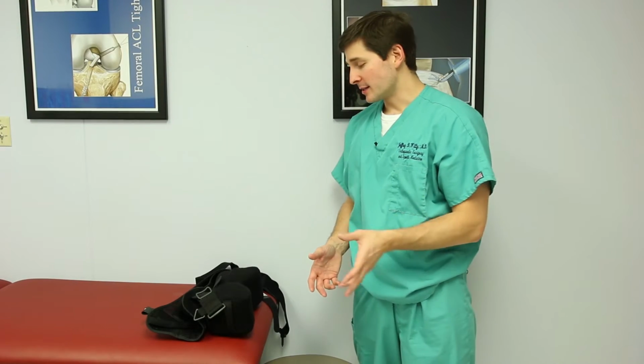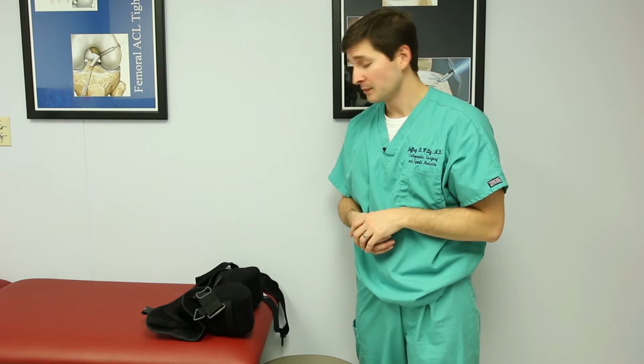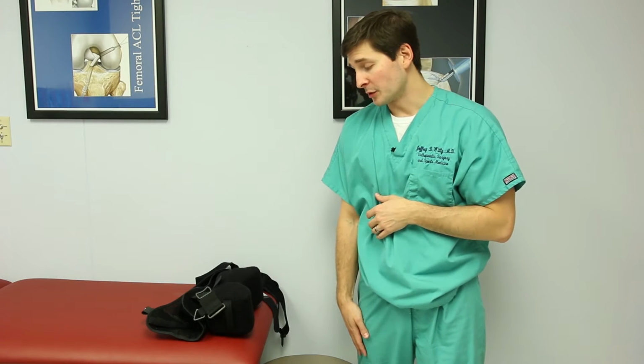What we're going to talk about next is how to put our sling and pillow on without actually having any help from an assistant. I get a lot of questions from patients about how to actually put their sling back on if they're by themselves, and we'll go over that right now. So let's pretend that my right shoulder is the injured shoulder, and we'll let that arm just hang at the side, and we won't actually use that arm during this demonstration.